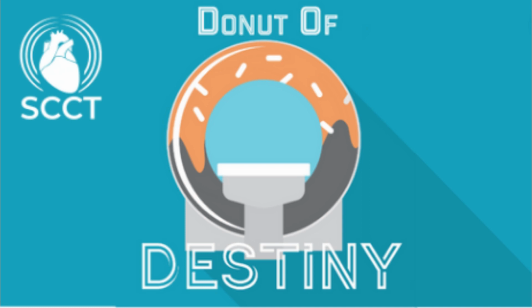That's 18% versus just 1%. However, this difference in strokes was based on HALT, and it wasn't present in the clinical TAVR trial data. So the investigators in this study also found that oral anticoagulation reduces the incidence and the progression of HALT, but clearly more work was needed.